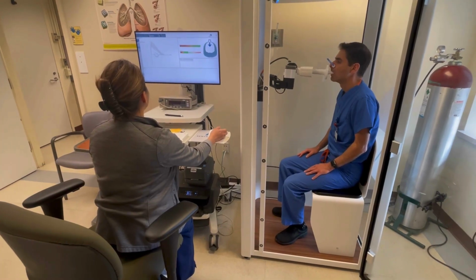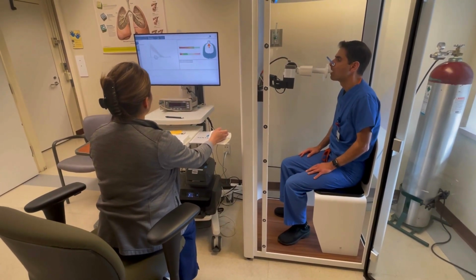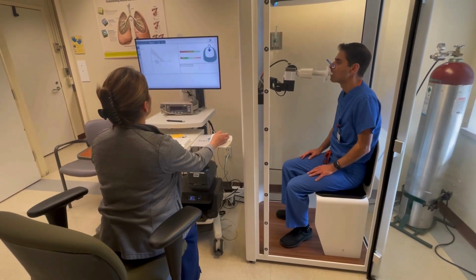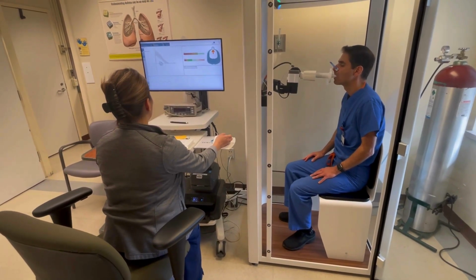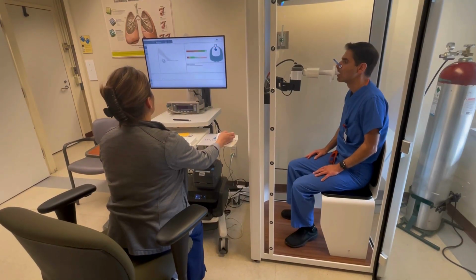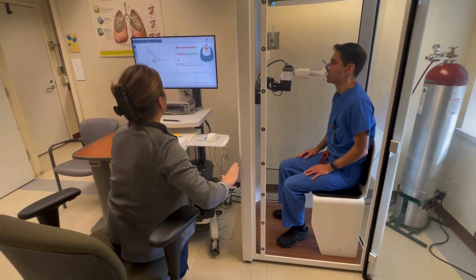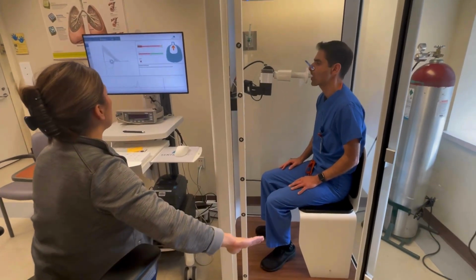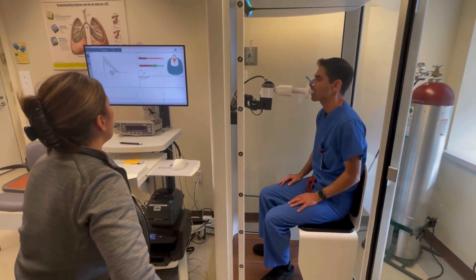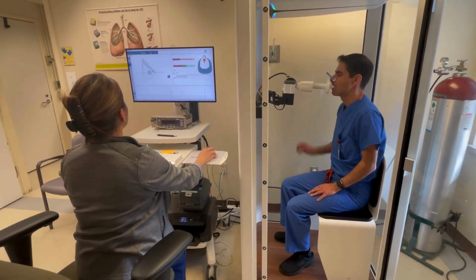Get a nice and easy, normal breathing. Doing good, nice and easy. Just getting your baseline. Okay, get ready. Big breath in deep. Let it flow. Push, keep going, squeeze it out, push. Almost there, keep going, almost there, push. And big breath in deep. Good, come on back. Take off your nose clips.